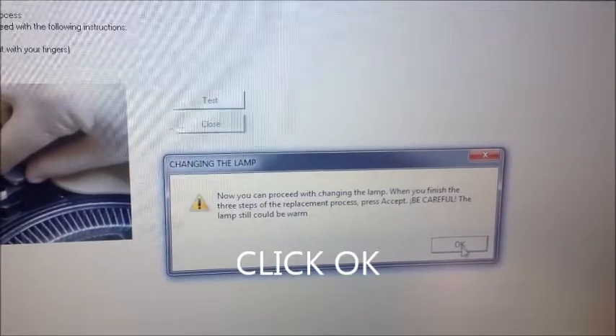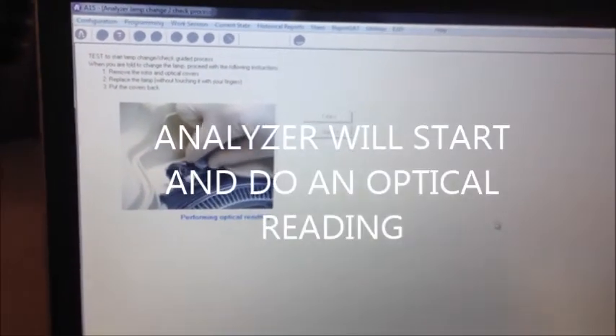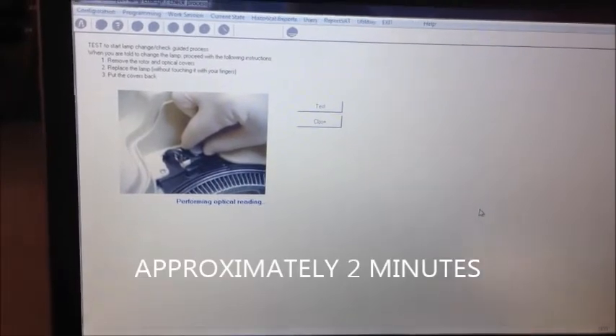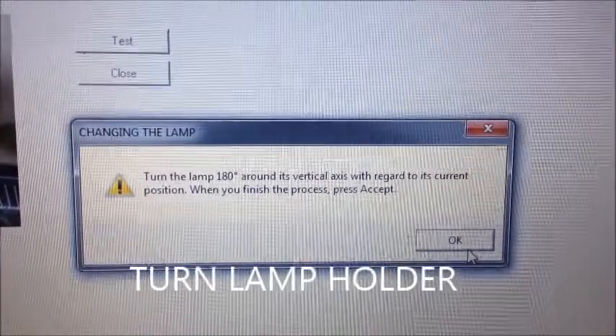Then click OK in the user software. The analyzer will now perform an optical reading for about 2 minutes. Then another window will prompt and ask you to turn the lamp 180 degrees around its vertical axis with regards to its current position.